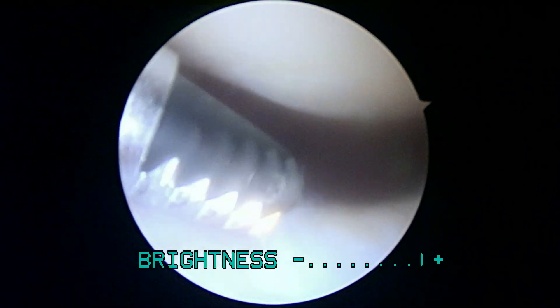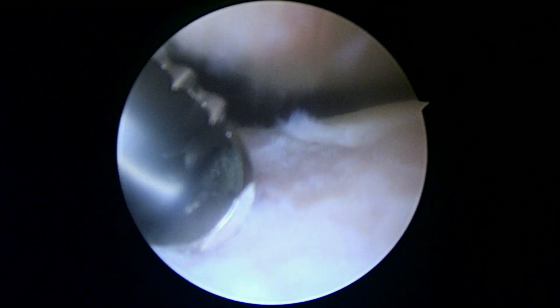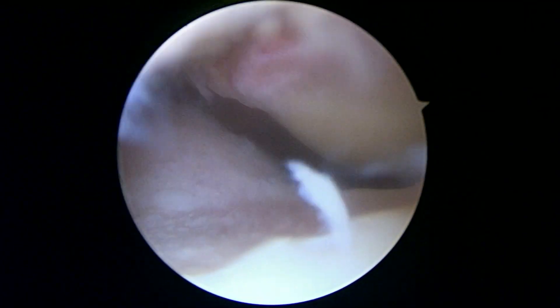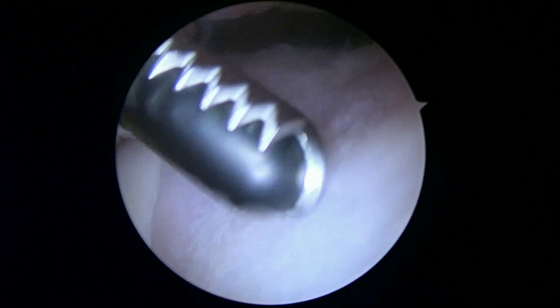This is the patella at the top of the screen and the groove that it glides in, called the trochlea, down below. We can see here that you've also got some loss of cartilage in the trochlea and even a little bit of a flap tear there. That's not too bad. But you've got some arthritis in multiple areas, and you can see the central trochlea here.